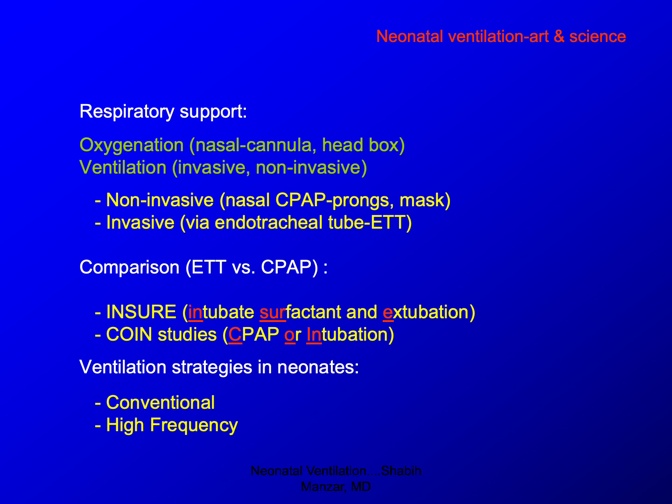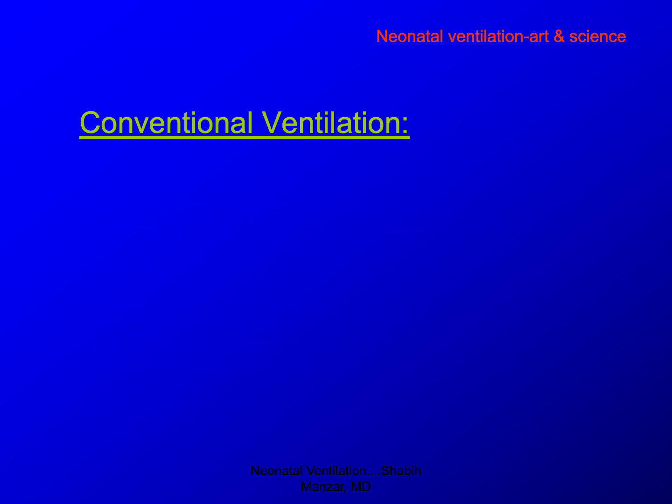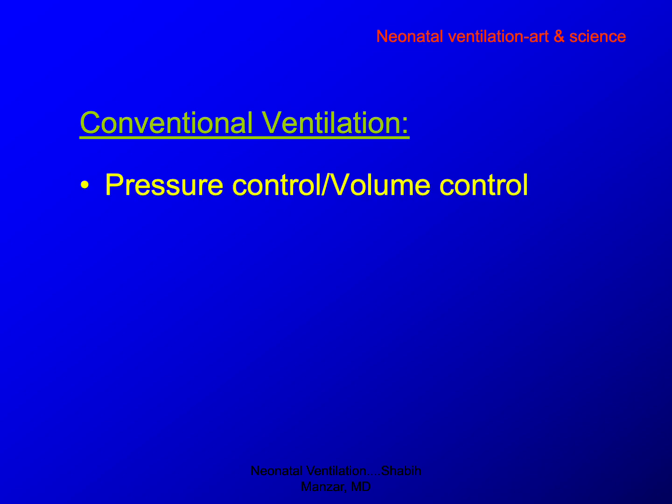Like I said earlier in the intro, that is conventional or high frequency. So let's talk about conventional ventilation. Conventional ventilation is pressure or volume control. Again, remember the word control. If the provider is controlling the pressure or providing the pressure parameters, that is pressure ventilation. If the provider is providing the volume, as in the ventilator, and the pressure and all that is calculated, that is volume. So again, in summary, if somebody says the patient is on pressure control ventilation, which means the pressure parameters are provided.